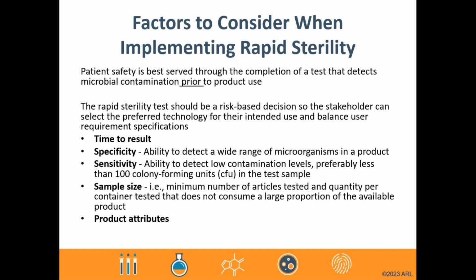Next is sample size. Do you or does your testing lab have different sample size requirements? Often this is still based on guidance from USP 71 in tables 2 and 3, or direction from USP 797 for smaller batch sizes. It's also possible that labs have developed a justification for modified sampling requirements.